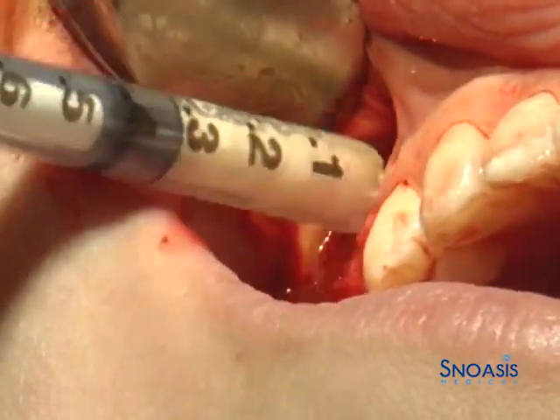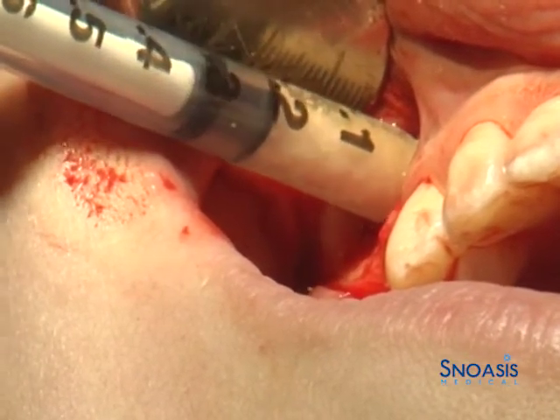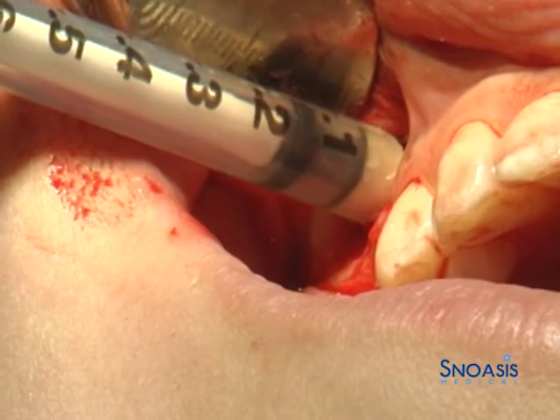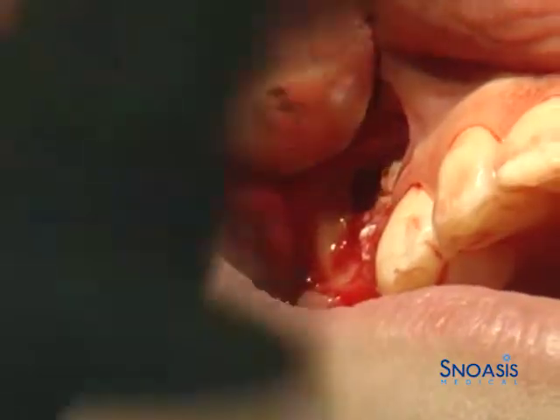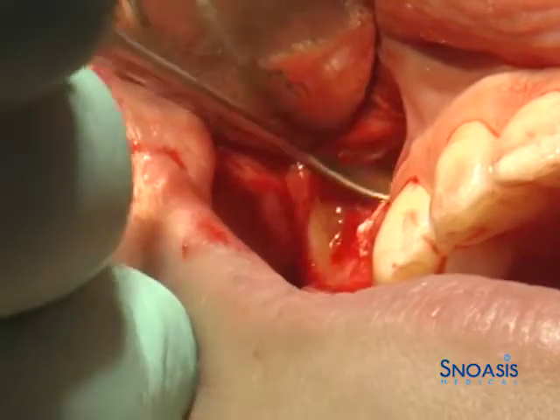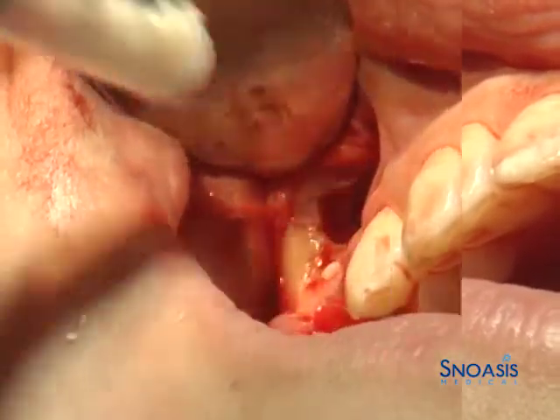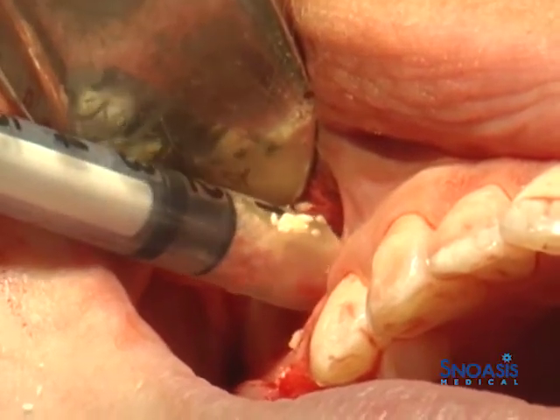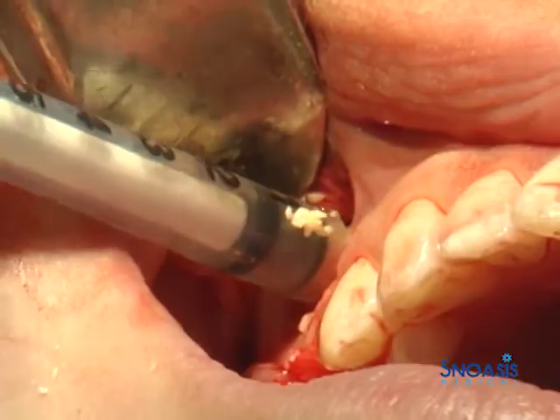A combination of xenograft bovine bone and allograft human freeze-dried bone is placed via a syringe into the sinus cavity and compressed towards the medial aspect. This is done prior to placement of the implant and final placement of particulate graft material.